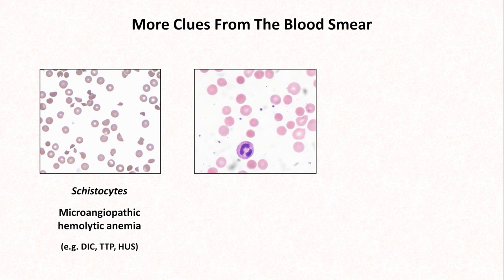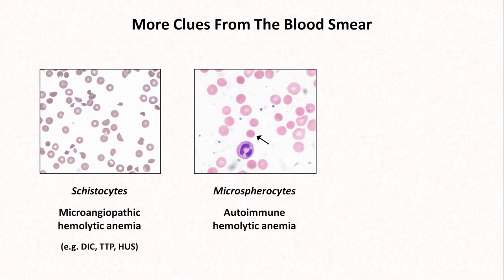This smear contains many microspherocytes, characterized by their small size and lack of central pallor, meaning that instead of having a normal biconcave disc shape, some of these erythrocytes are spheres. This is typical for autoimmune hemolytic anemia. Spherocytes — not necessarily microspherocytes, but spherocytes in general — are also classic for hereditary spherocytosis.